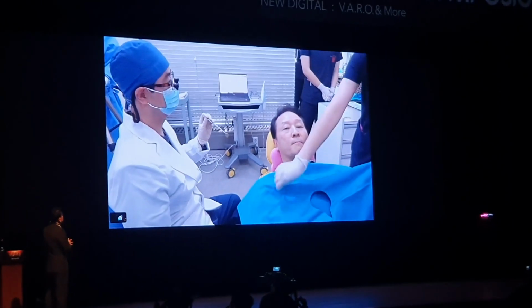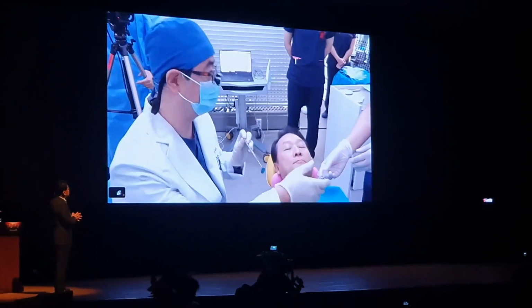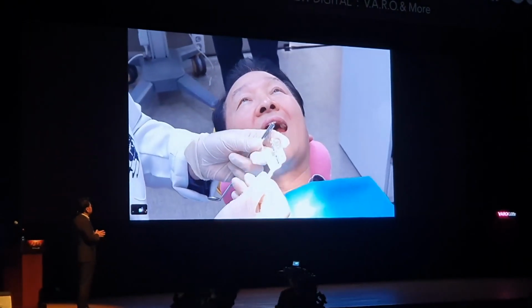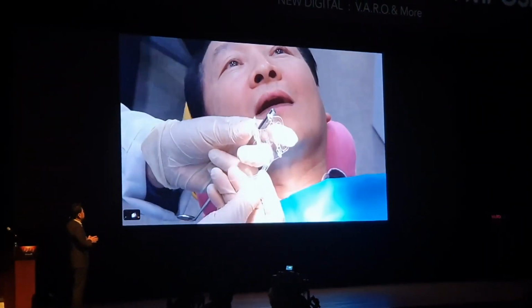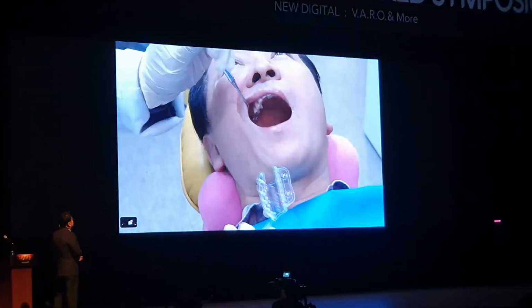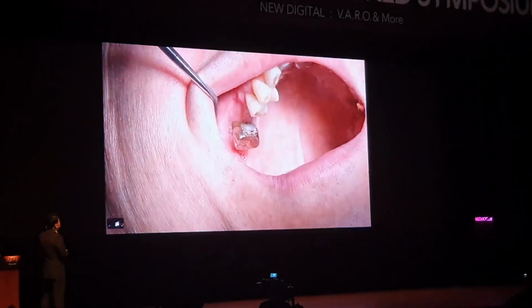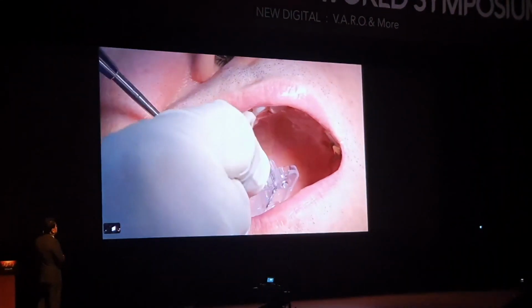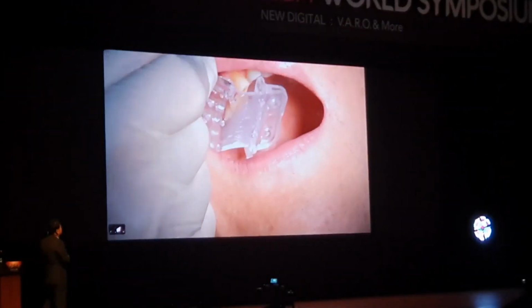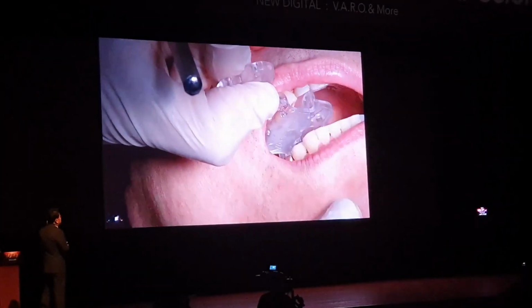Then first, start with the pre-guide indexing. Yes, please prepare the trial tray. So now I have the trial tray in my hand. I'll be using PGS13 for this case, and I have the identical trial tray here as a PGS13. This step is very crucial. On site number 16, positioning the PGS guide. Slightly right down, please. Taking a bite registration stage.